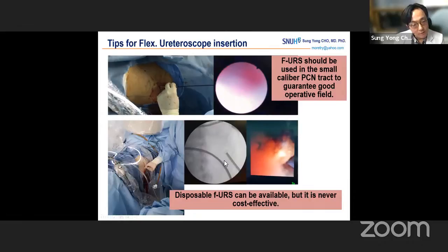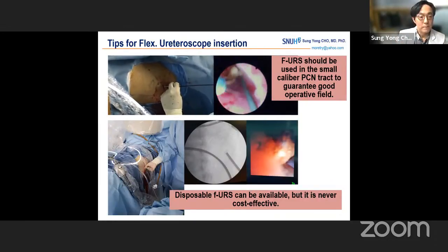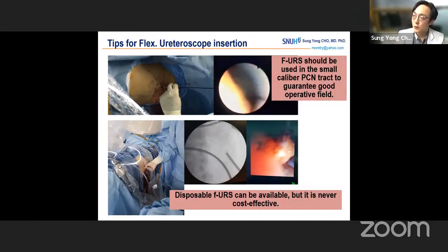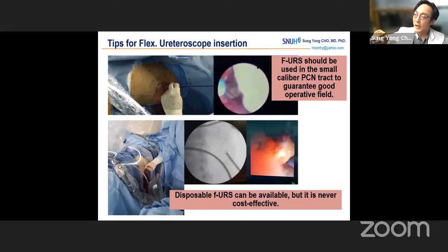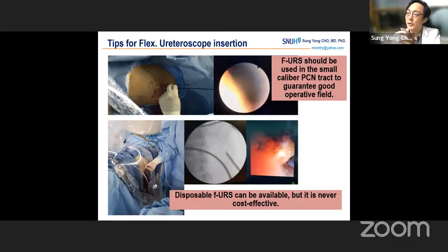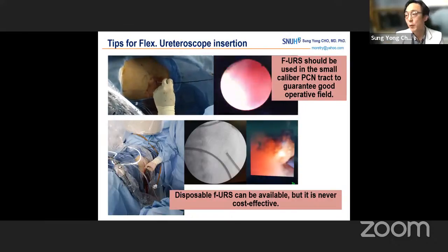There are many tips and tricks, even when the leading surgeon wants to handle the flexible device through the percutaneous tract or the ureter. We all know all of these things derive from the fragility of the flexible scope. So when the main surgeon wants to put the flexible ureteroscope or flexible nephroscope into a specific calyx or position, sometimes the second surgeon or the assistant should grab the percutaneous tract sheath, so as not to make some angle or external surface damage to the flexible scope. It's very important sometimes, right?